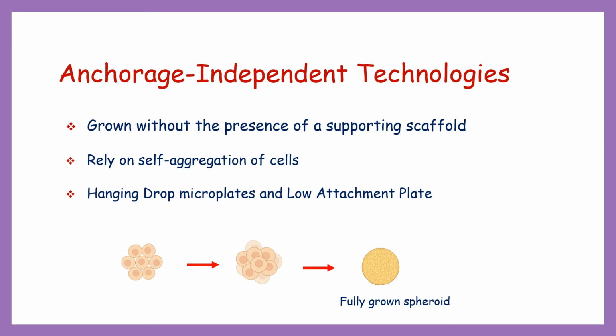These spheroids can recapitulate physiological characteristics of tissues and tumors with regard to cell-cell contact, and they can synthesize their own ECM, which can allow for natural cell-cell matrix interactions. Spheroid size depends on the initial number of cells seeded, and spheroids can be grown to a size where they can display oxygen and nutrient gradients similar to tissues.